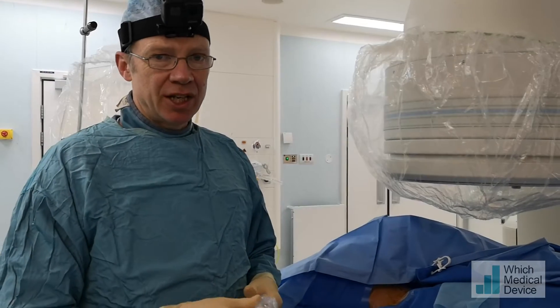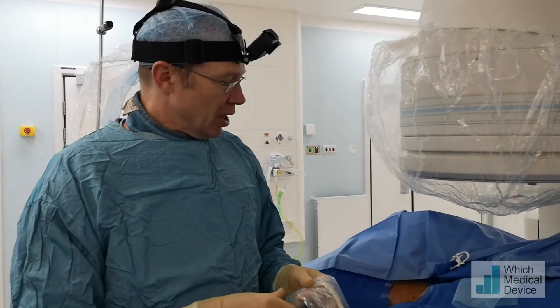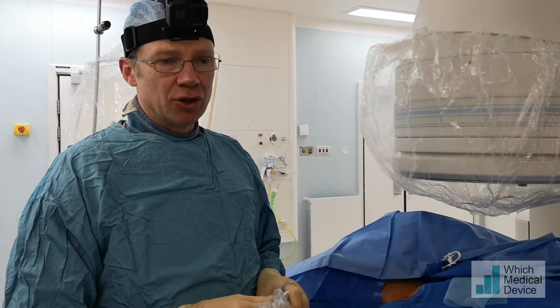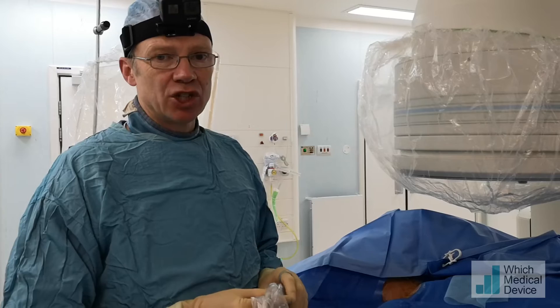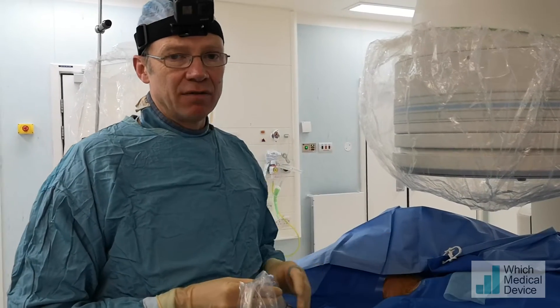We're about to do a left varicocele embolisation on this gentleman who's got pain on the left side. He's got proven varicocele on ultrasound, and we're going to use a right jugular approach, because this is very much a straight line down to the left gonadal vein.